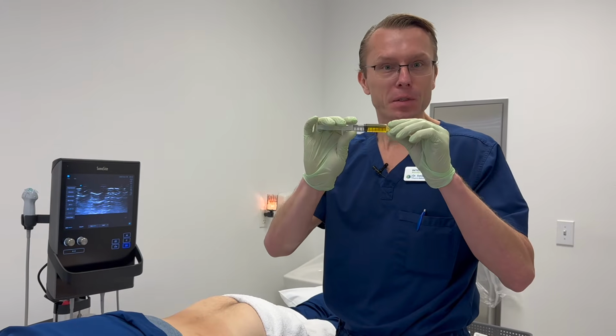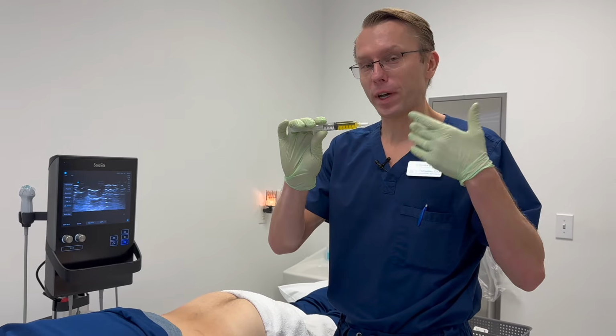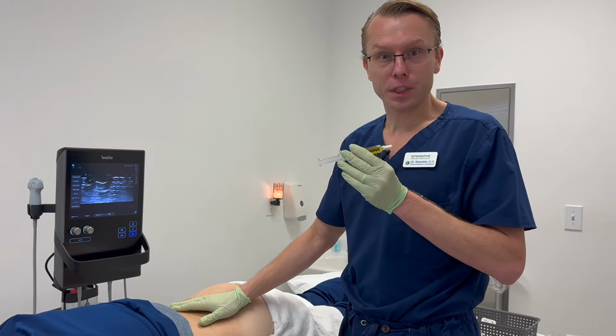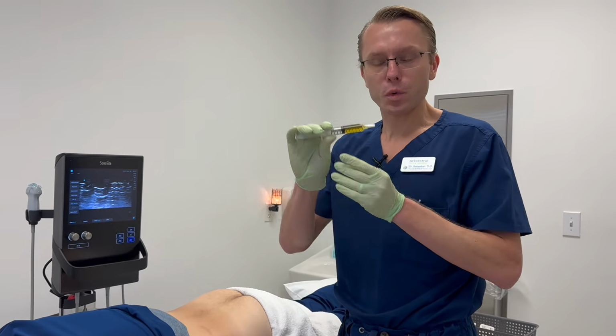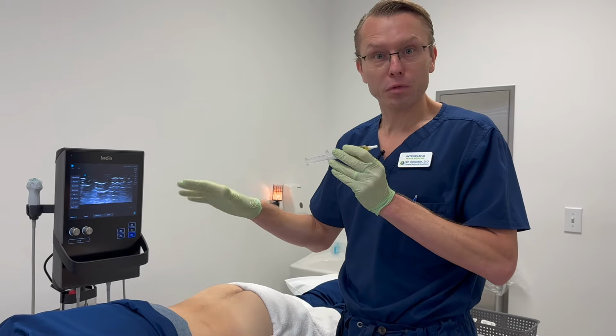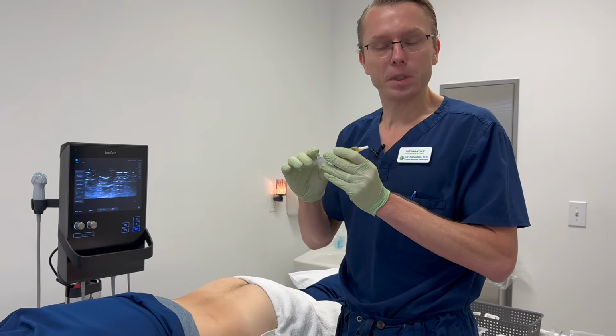This is the platelet lysate that we're going to use to inject this patient. The platelet lysate is made from platelet-rich plasma that's further processed, and then the growth factors are released. This patient has degenerative discs and a disc tear, so we're going to do the caudal epidural with the platelet lysate, and it's going to spread around his nerves and around the disc, and it's going to help him with the pain, and help the disc heal a little bit.